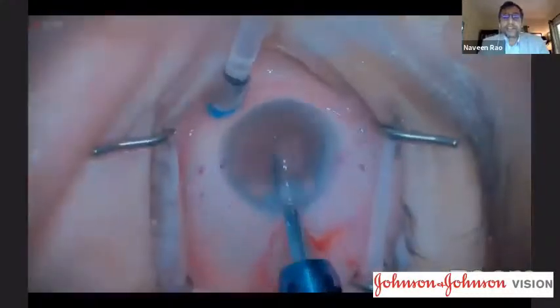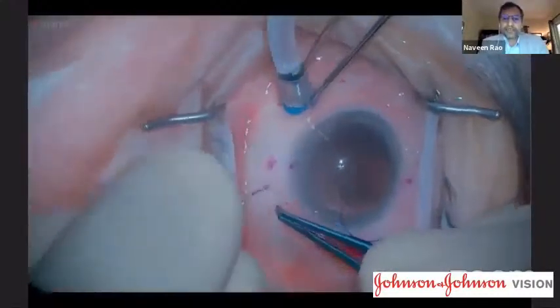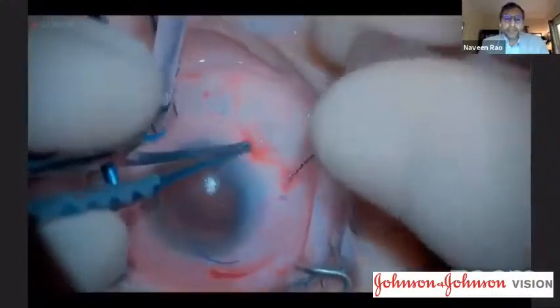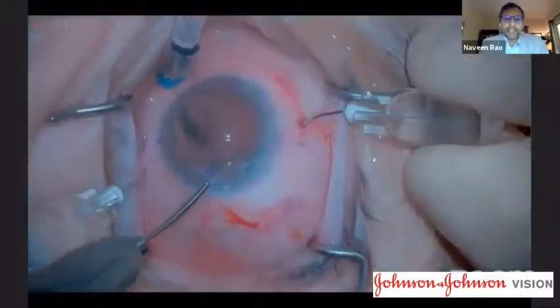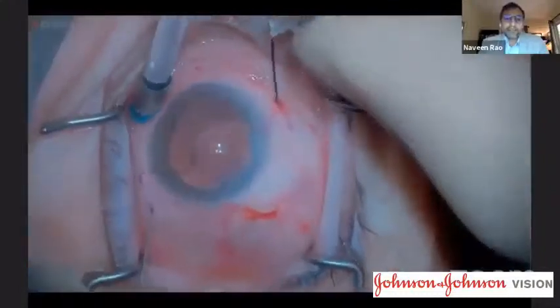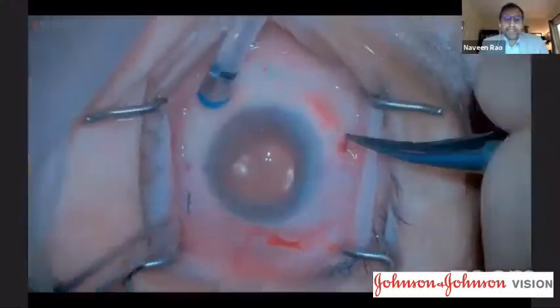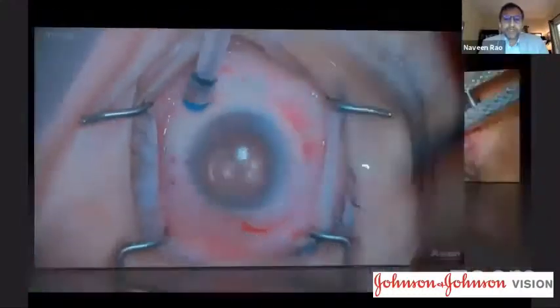I'm inserting the three-piece lens with the leading haptic on the distal iris, the trailing haptic remaining outside the wound. The first needle is inserted and the haptic is docked with a micrograsping forceps. Then the second needle is inserted and the trailing haptic is docked. I like to insert the trailing haptic through the main incision, but some surgeons like to put it onto the iris and then reach in with a paracentesis. Once we've made the flanges, we nudge those back into the sclera.